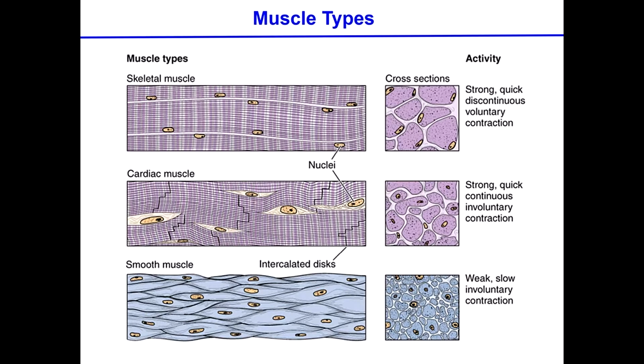And when you look at them from a section point of view, in the skeletal muscle, you're going to see always the nuclei in the periphery, all right? And when you do a heart, it's going to look pretty much the same. It's going to be a muscle-looking structure, but the nuclei, whenever visible in that particular section, are going to be centrally located, all right? And if it's a longitudinal section, you're going to be able to distinguish between the homogeneity of that picture and the kind of funny-looking heterogeneity in terms of the cellular limits, boundaries between one and the other. All right?